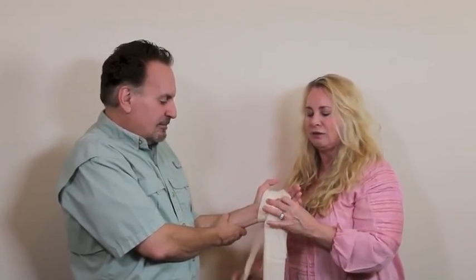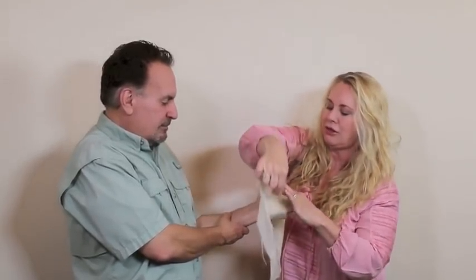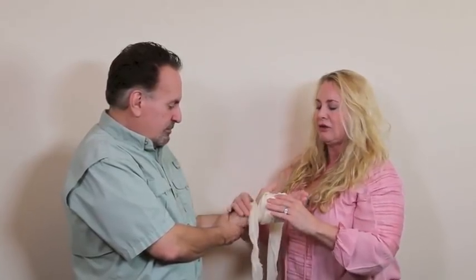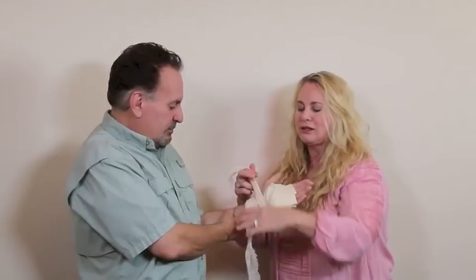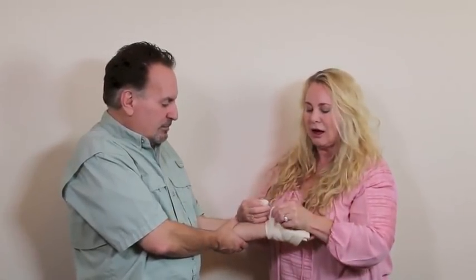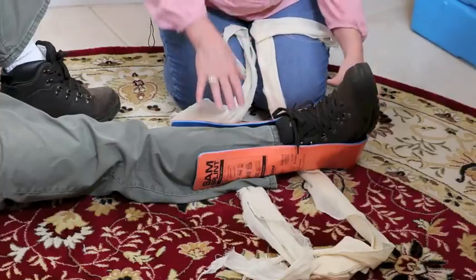Wrap the long piece by the thumb, go around to the pinky, then under toward the thumb at the wrist and let it hang. The last step is the thumb: take that piece, go around the wrist. If it's too long, wrap back around and come to the top, placing your knot there. Thumb, pinky, pinky, thumb — that's how it looks.